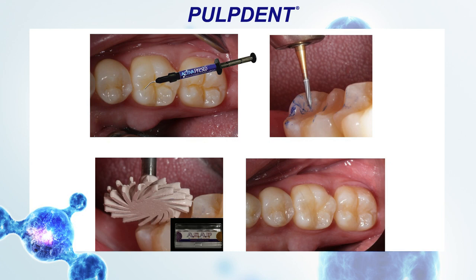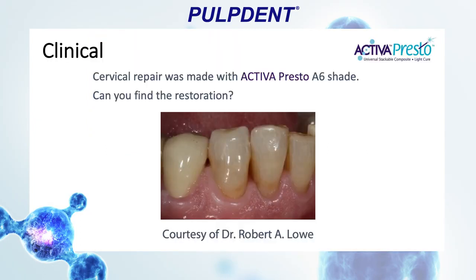Once light cured, making minor adjustments with a carbide rotary composite finishing burr and ASAP polishers to really create restorations that are barely visible, let alone taking away healthy tooth structure, as we were taught in school in our extension for prevention cavity preparations.